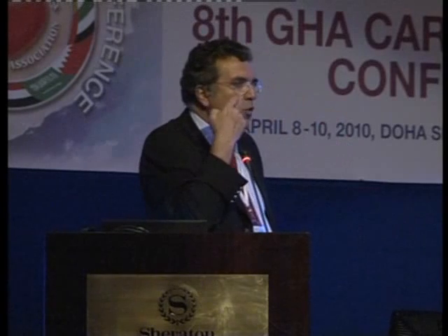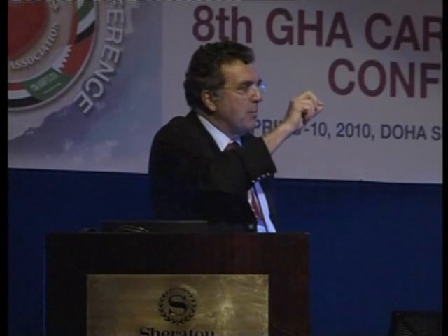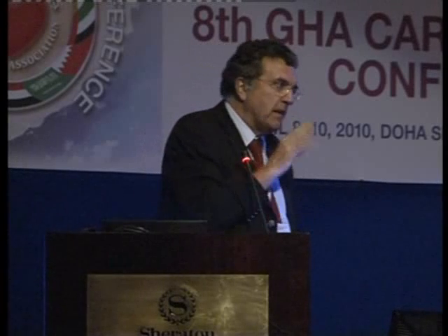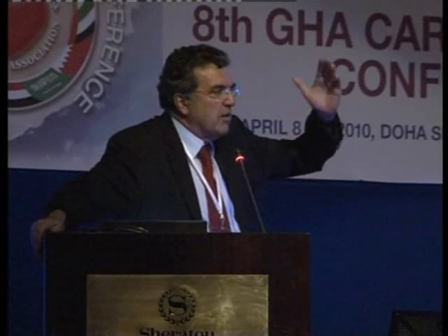The third point, a good indicator, as in this case, is the presence of a significant baseline gradient. If you cross the lesion and you see a gradient of more than 10 millimeters of mercury, this is a very good point. In this case, when you cross the lesion, there was no pressure gradient at baseline. So there is a very low chance of having a positive FFR.